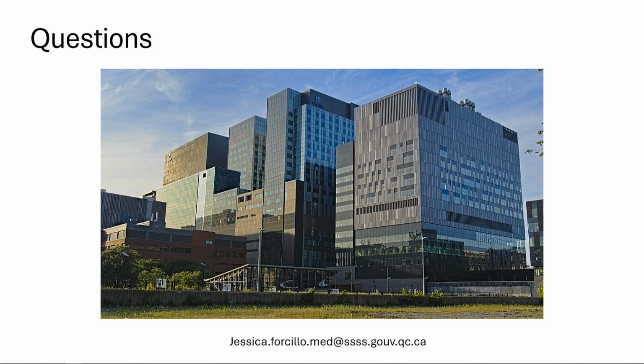So it seems that for TAVR, transcatheter aortic valve replacement, we need more precise assessment of the anatomy because we don't have so much control, and therefore anatomy really has a big implication on the selection of the prosthesis. While for surgery, probably you don't rely as much on the anatomy, and you can change on the moment. But how much does anatomy impact your decision to do surgical AVR or transcatheter AVR? I mean, you can do both, but is it only a problem of comorbidity or also anatomy?